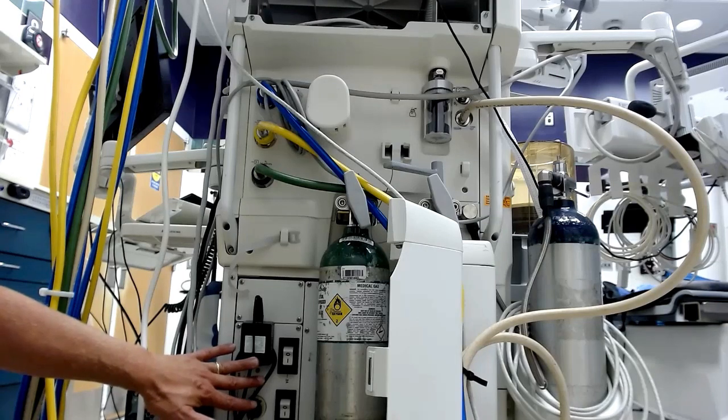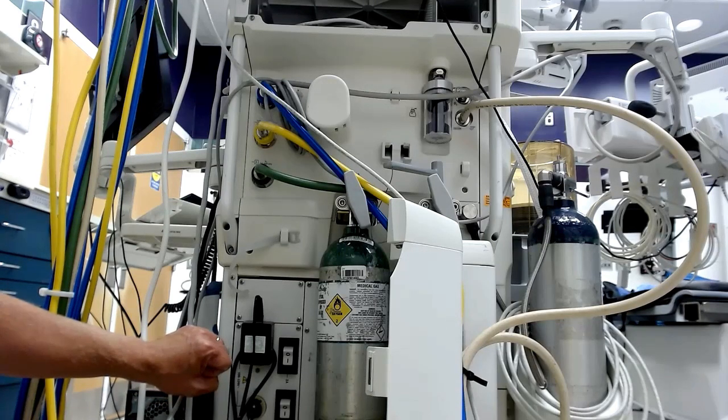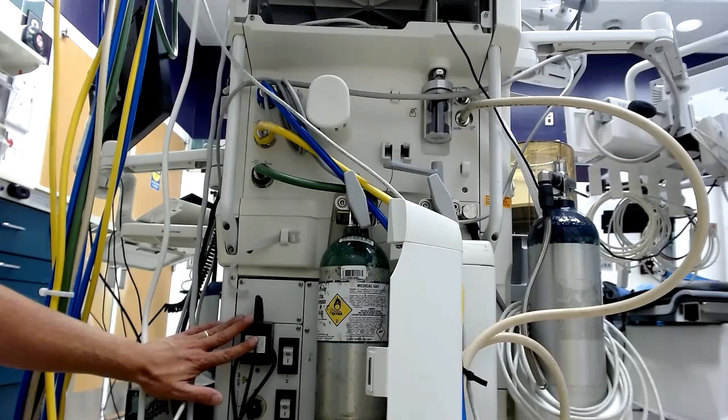And this is for us to plug some of our essential devices into, some of our monitors, electronic medical records, and so forth. This is not for anybody else to plug anything into. We always caution with that because it could cause your machine to overload and fail. Could cause it to short circuit. But this is where you'll see some of the power for what we need plugged in.